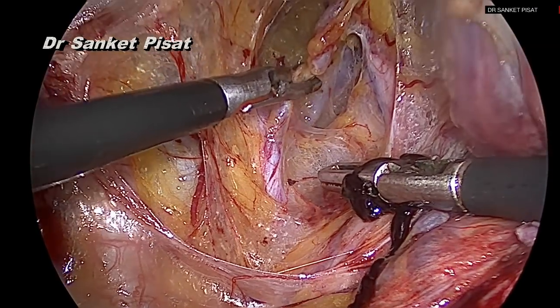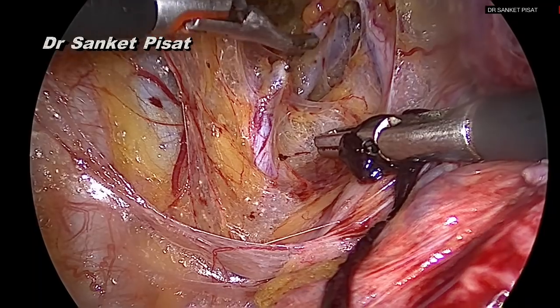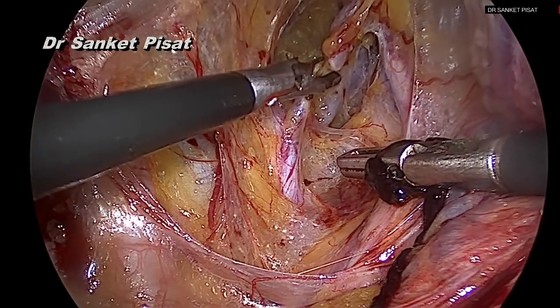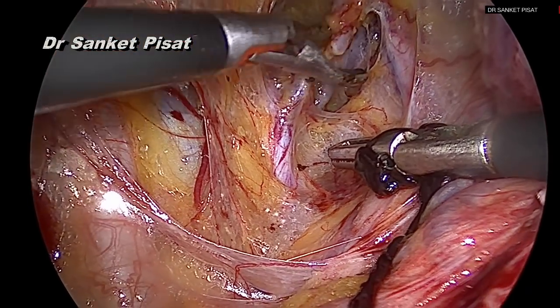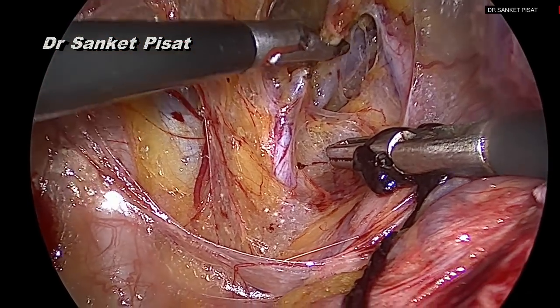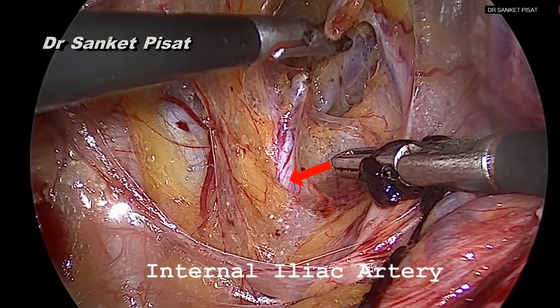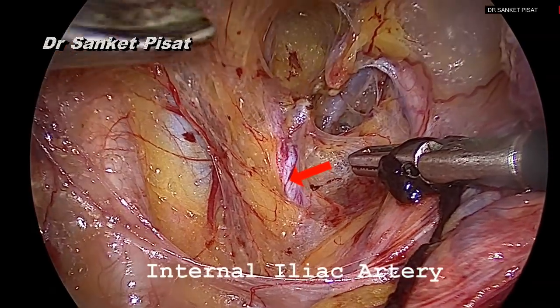The uterine artery has now been sealed. It is not necessary to divide the uterine artery at all times — just sealing it using either a harmonic scalpel or bipolar energy is good enough to stop the flow of blood and therefore to achieve hemostasis. The internal iliac artery is also seen here, from where the uterine artery takes its origin.